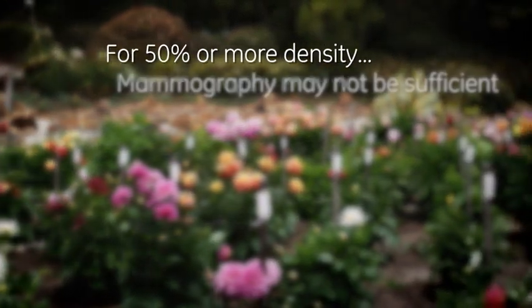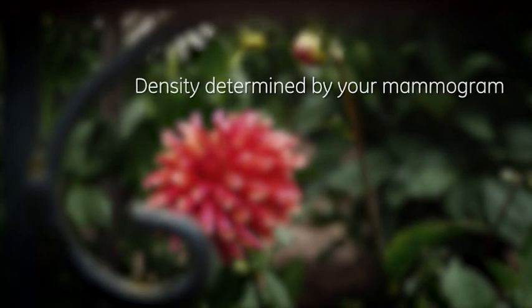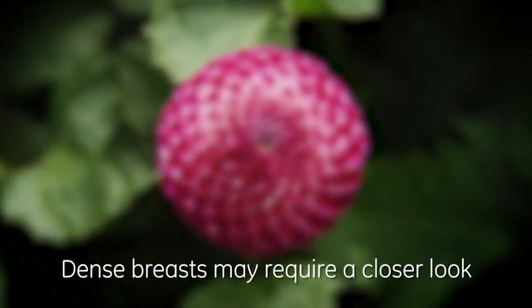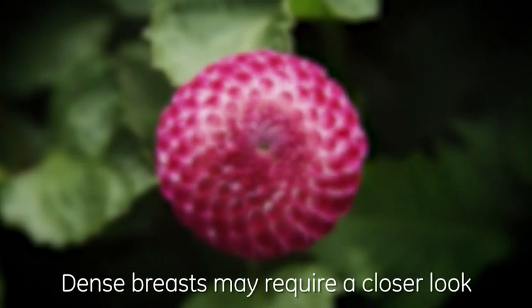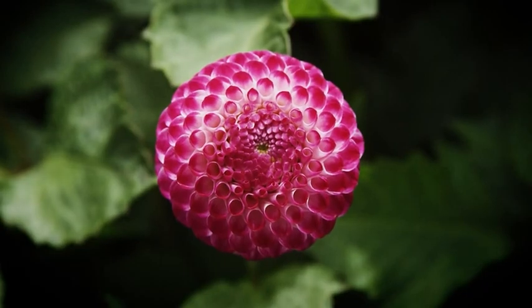More than 50% dense, mammograms may not be sufficient for screening. Breast density is identified through an assessment of your mammogram. If you are informed that you have dense breasts, your physician may suggest another screening exam with 3D ultrasound, which can view dense tissue clearly, does not expose you to any additional x-rays, and is relatively comfortable.